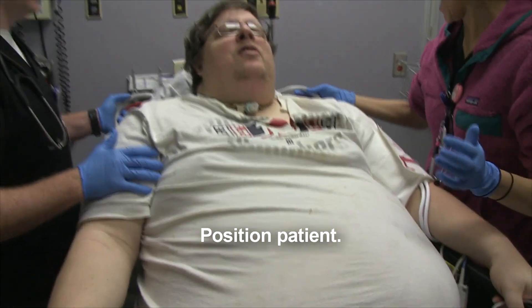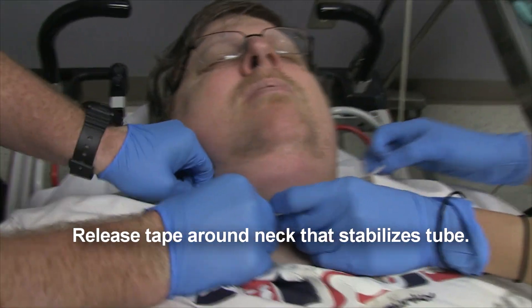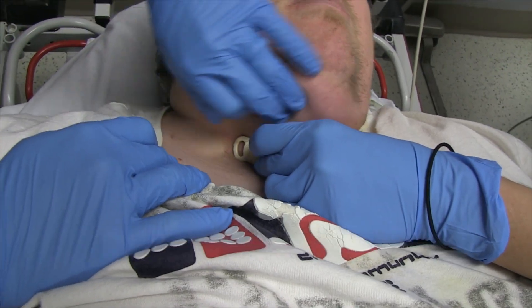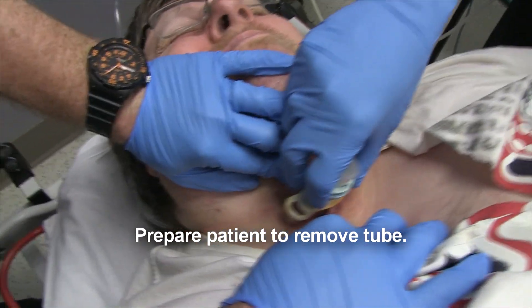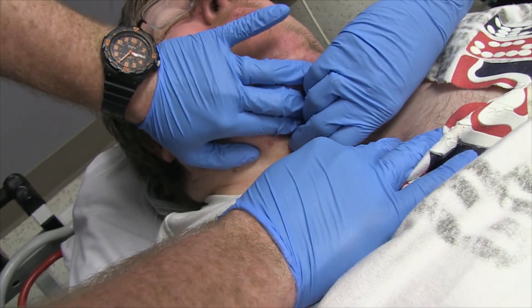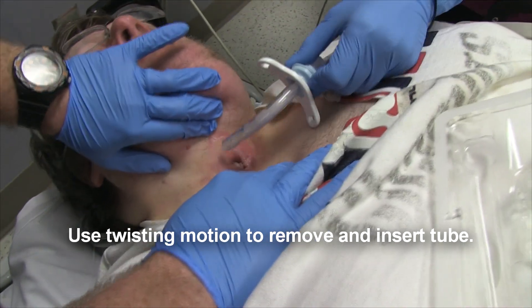All right, we're going to wait for that. He can do it — he's tough. Just basically holding this back. All right, we're going to have this ready. You're okay, I haven't pulled it yet. One, two, three — here you go, there you go.